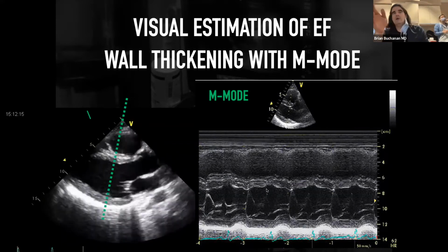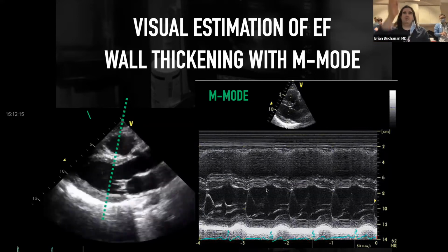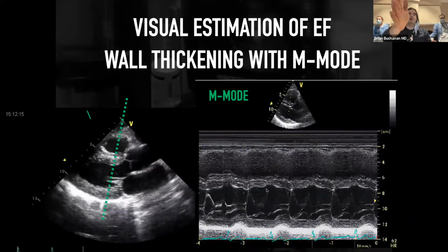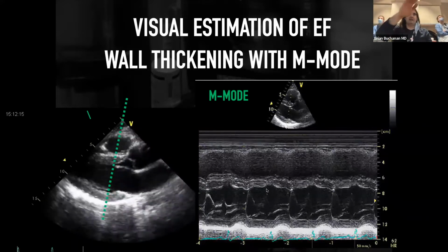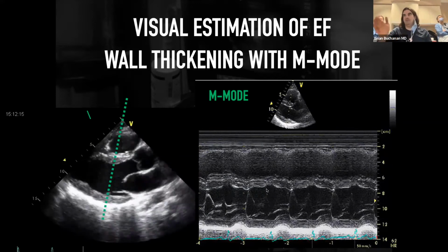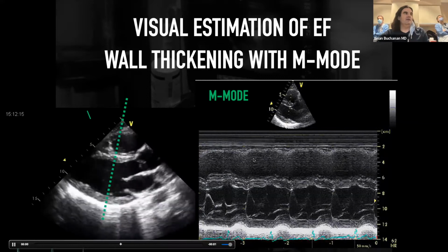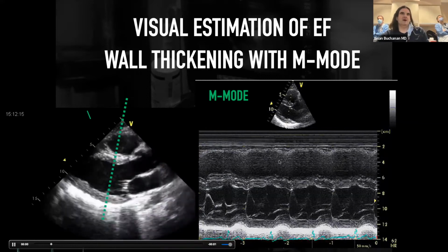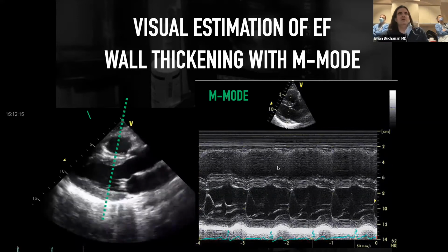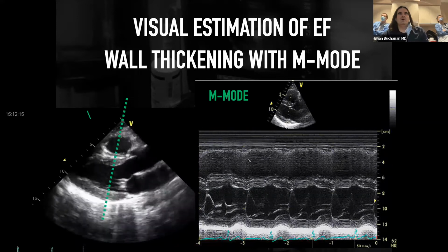Because M mode, again, is time motion mode, and what that means is your image is along the y-axis, and along the x-axis it's not more anatomy. It's just the same plane repeated over time, right? That's the motion part. So the frame rate of M mode is extremely high, much higher than say 2D. It's around 1400 frames per second versus 2D, which is around 56 frames per second. So it's a very high frame rate.